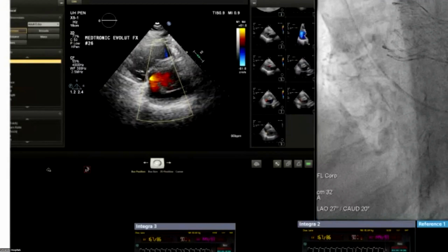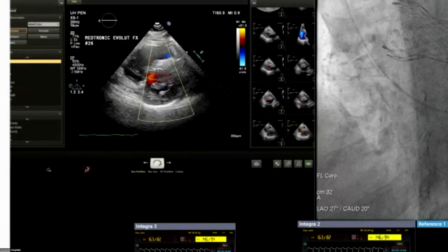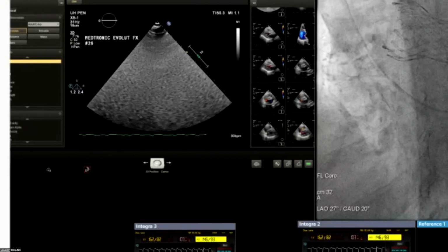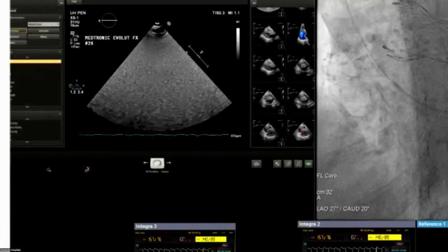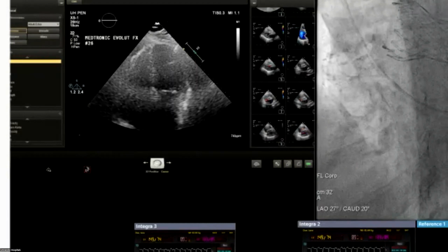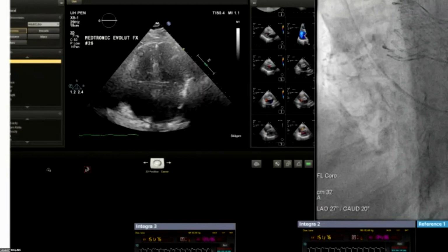The valve canted, which is normal, right? Whenever there is the interaction of the valve with the native annulus of the patient, there's going to be canting. That's normal and expected. But as you could see, the valve was in a very, very stable position. There was no movement, aortic or ventricular, in the final deployment.